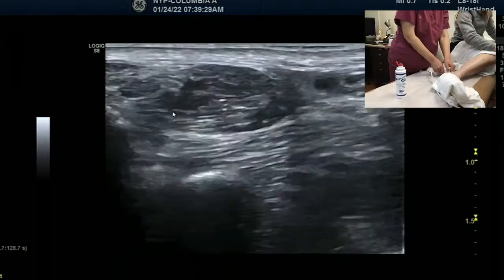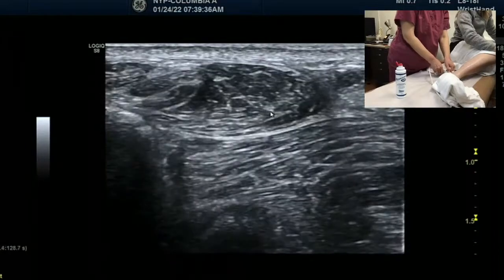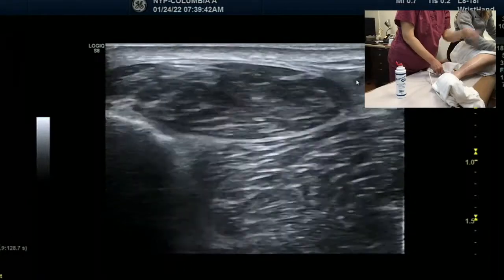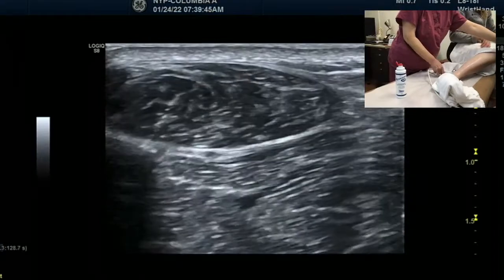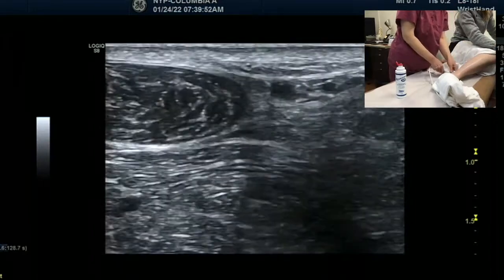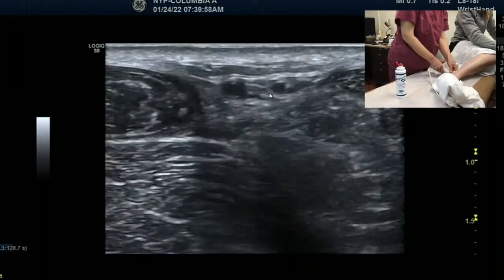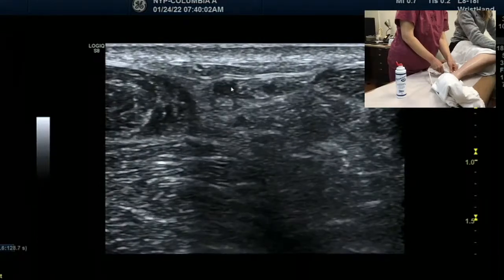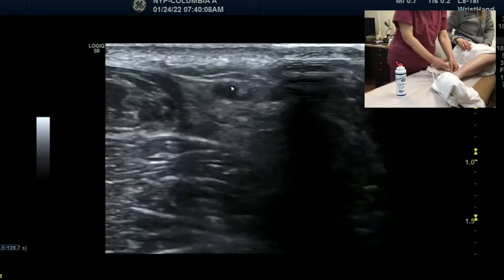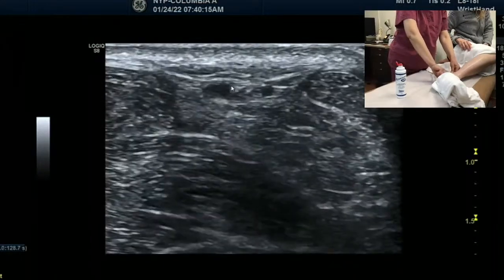Great. Okay, and then small saphenous, so peroneus brevis. And then you tell me where's the nerve? I see it over here. Above. So small saphenous vein, but with this position, it's this one. You see honeycomb? So here's the honeycomb shape of the sural nerve at the level of the lateral malleolus, just a little proximal. And to the left of it is our small saphenous vein. The reason we are struggling is because it's slippery, but it's about two finger breadths up from the lateral malleolus. Two finger breadths, right?